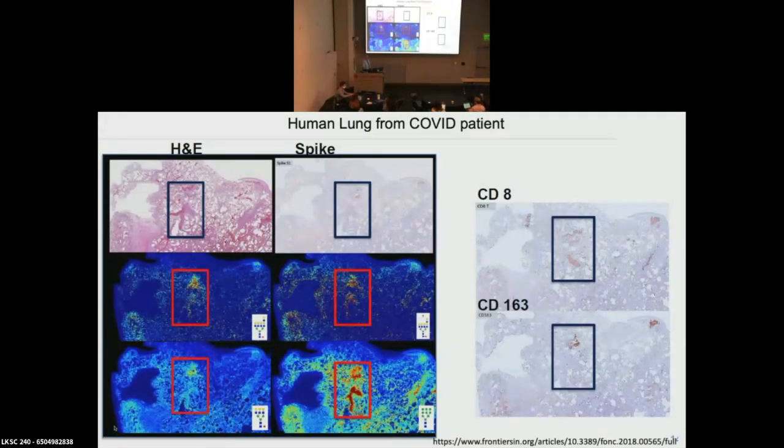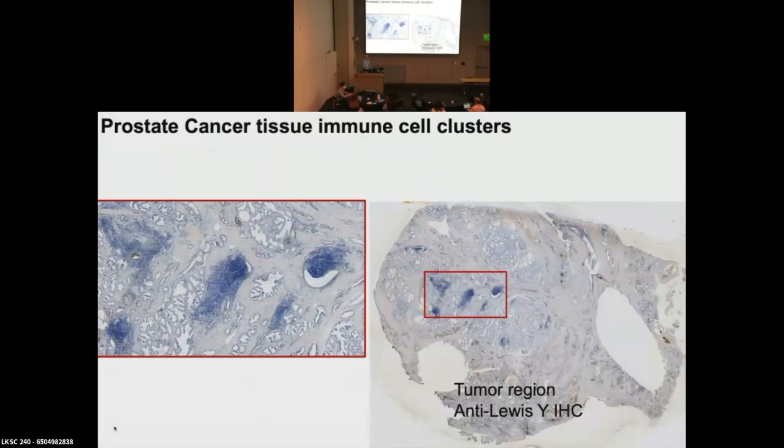Originally, my colleagues at the FDA just did a bunch of single IHCs to link where the CD8s and the CD163, the different markers, were, and we started lining up and mapping the individual glycomes, co-localized, because we could co-localize everything to the same tissue. A lot of times we'd start with tissue that was stained already, so there was no challenge to line it up. So this was published already.